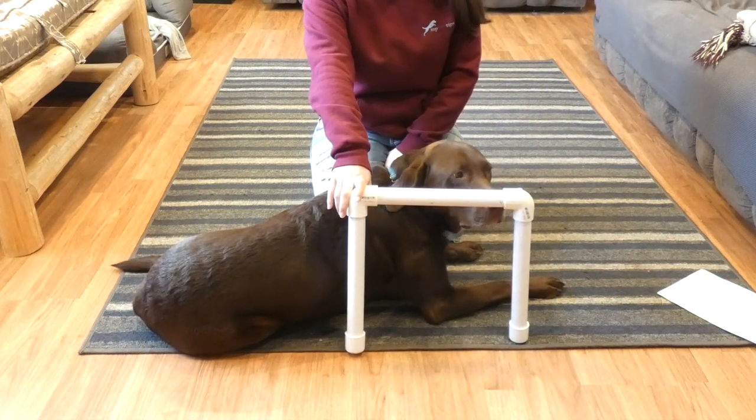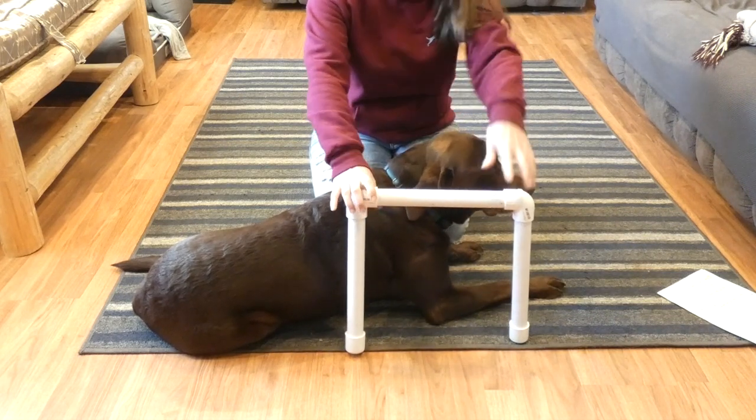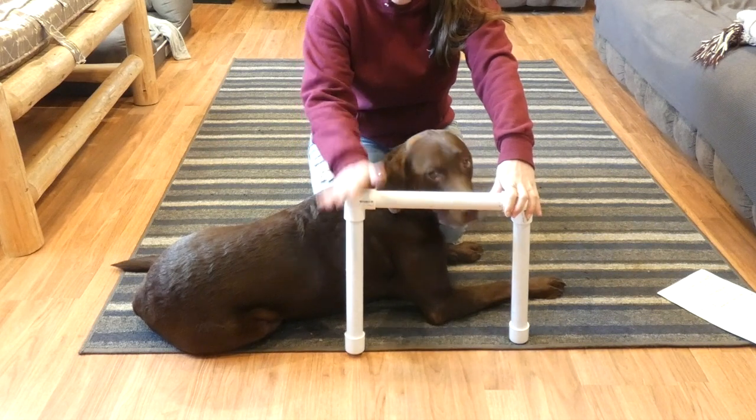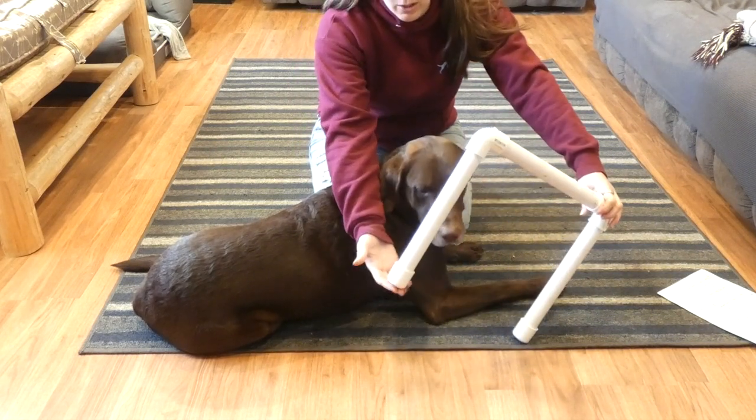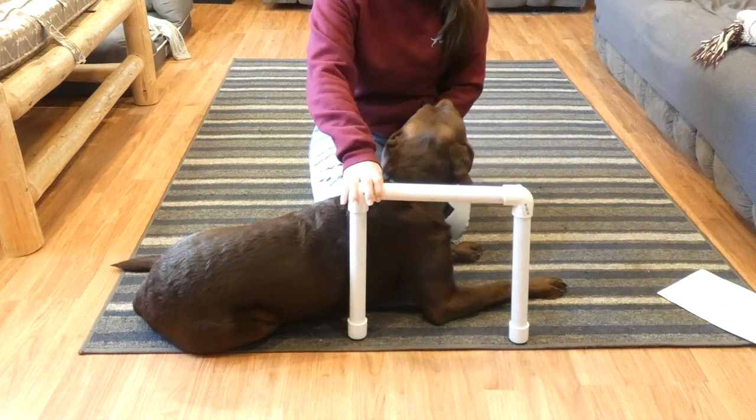Obviously a bigger dog is going to need bigger, stronger piping. You're also going to need a saw to cut the piping, and you're going to need fittings like these. These ones are called elbows and these are called caps, and you're going to need the fittings to put it all together.